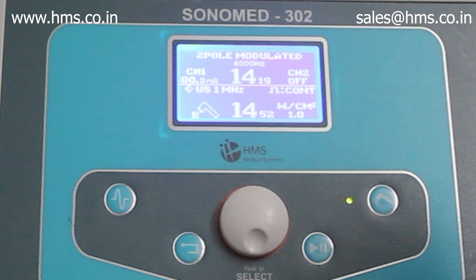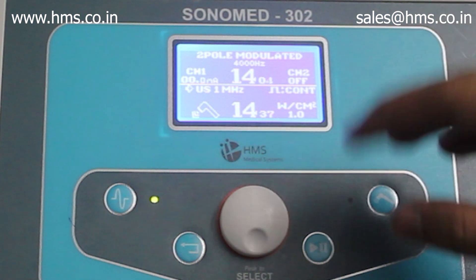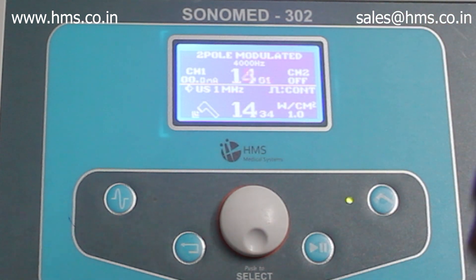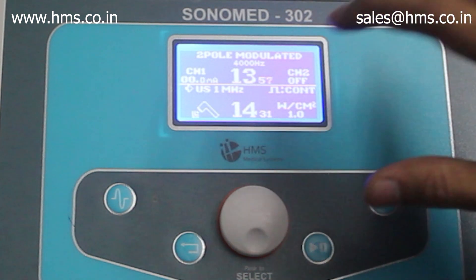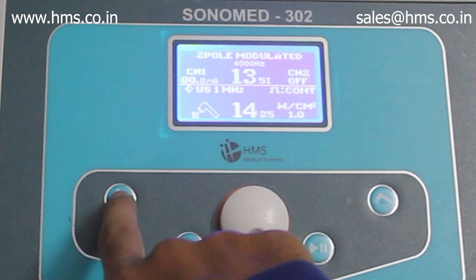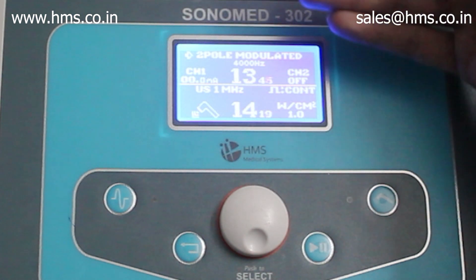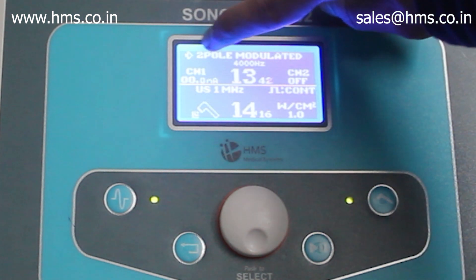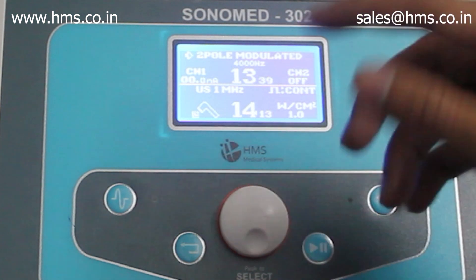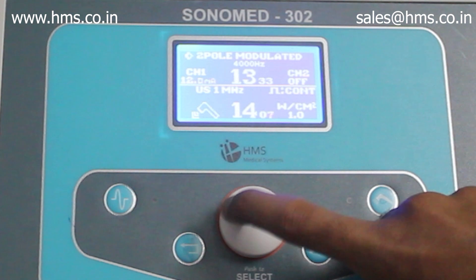This simultaneous operation is the main feature of the Sonomit 302 and is not available with any other machines from Indian manufacturers — this is the first time it's being done in India. To switch between modes while the machine is running, press the electrotherapy button; the small arrow on screen indicates whether you are in electrotherapy or ultrasound mode. To increase the intensity for electrotherapy, rotate the knob in the middle.